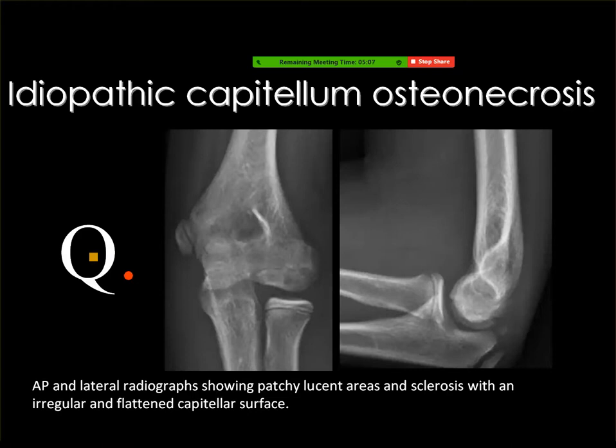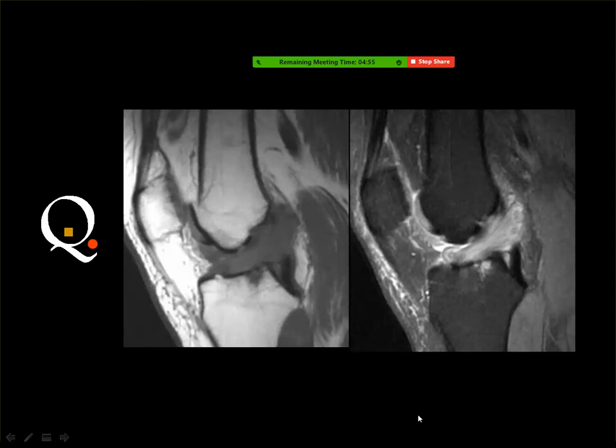No, I don't know this variant actually. I know that this Little League injury affects the medial apophysis of the humerus. Okay, and let us move to this case, which is also a spot diagnosis case.